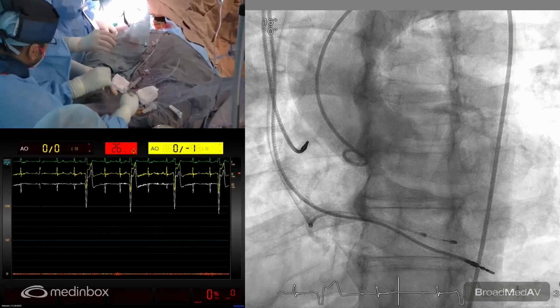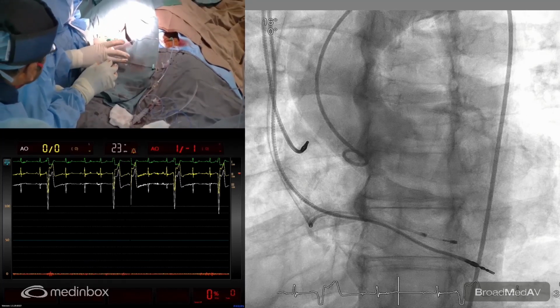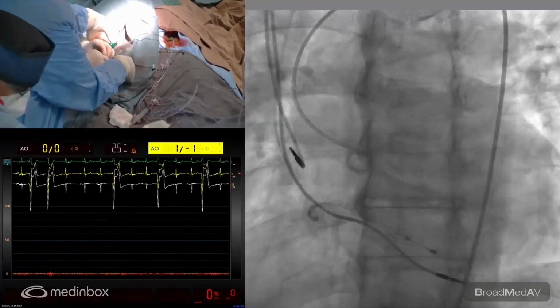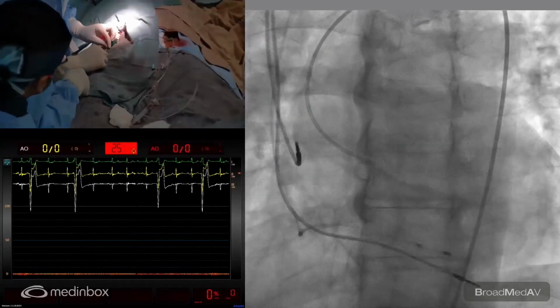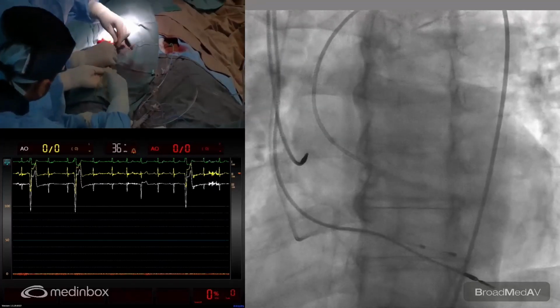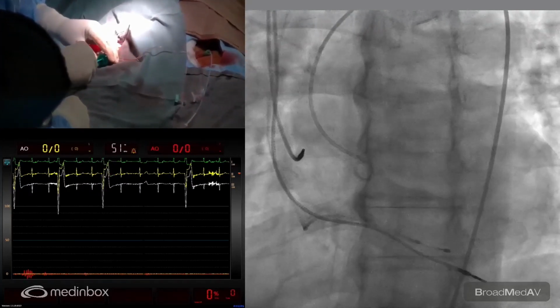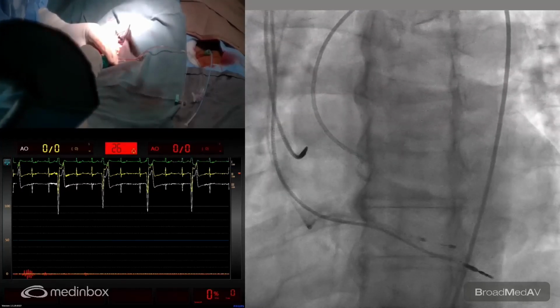Wire. So this is the Merrill crimper system with a clock, so that we can easily align exactly at 2 o'clock, 3 o'clock, 1 o'clock. You call this system a crocodile? Yeah, the Core Align crocodile crimp system. So we can see from 9 o'clock to 3 o'clock the clock positions are there.